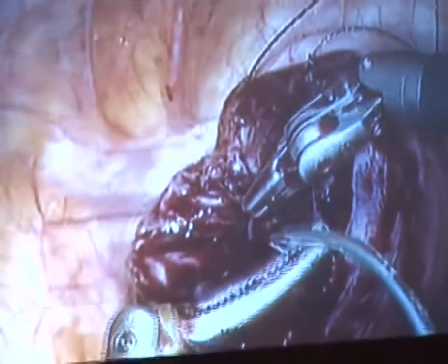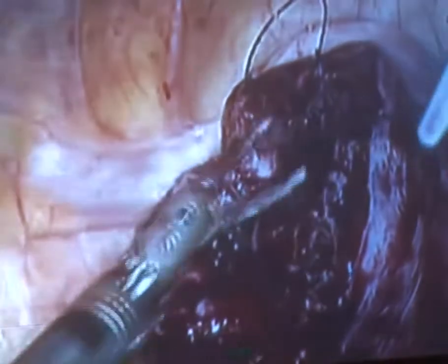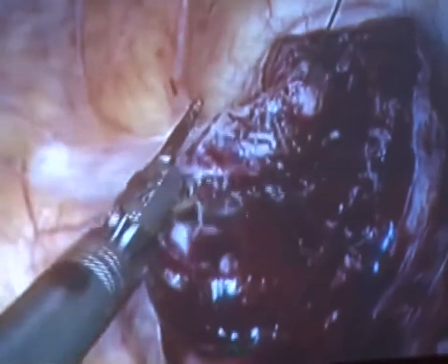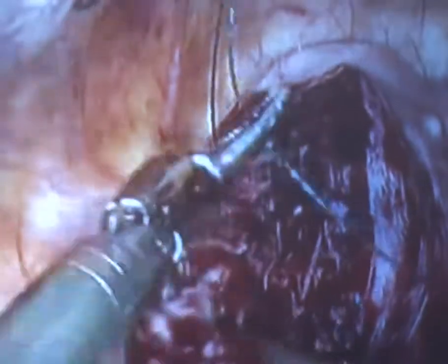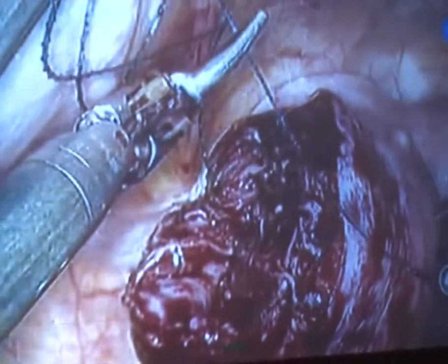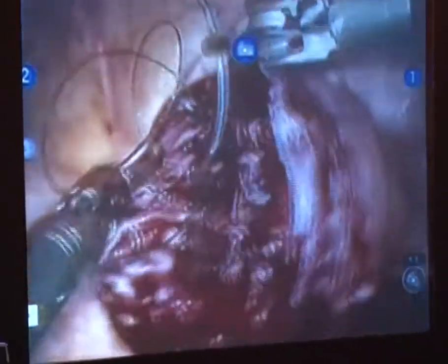But to get back to that study I was talking about, they did a sheep study. They compared quill, which is another type of barbed suture, with traditional Vicryl, and they found that there is no difference in blinded reviewers in this longitudinal survival study. They took sheep, made two incisions, closed one with a barb, and the other one was closed with Vicryl. They survived the sheep and then sacrificed them several months later, and they blinded the reviewers. And there is no difference in the rate of adhesion formation between the two sutures used.